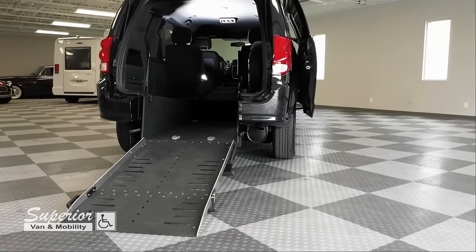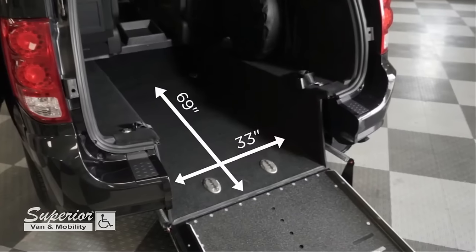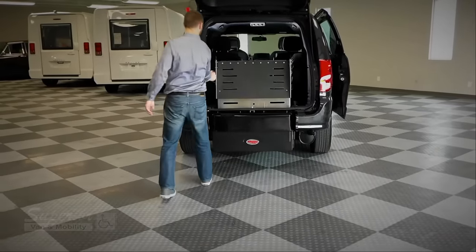Inside our conversion, you'll find one of the largest interior spaces in the industry, accommodating 99% of all wheelchairs, scooters, and people. Stowing the ramp requires the same effort as picking up a gallon of milk.